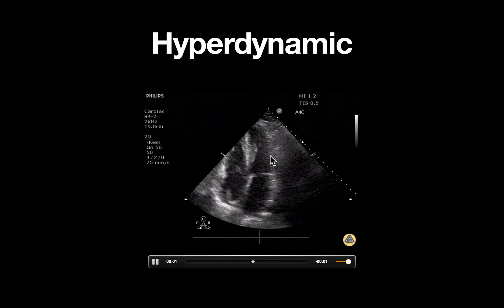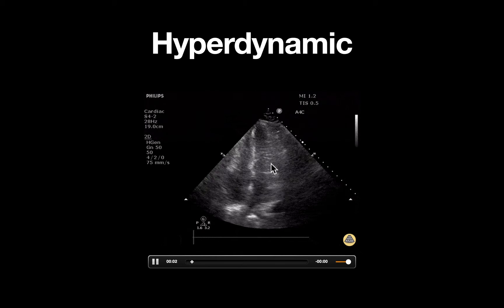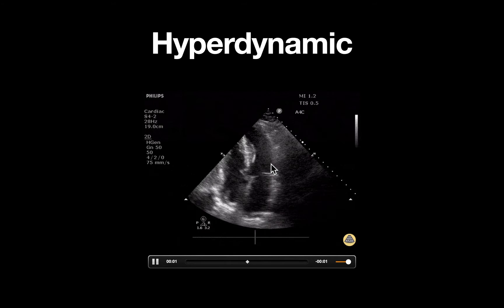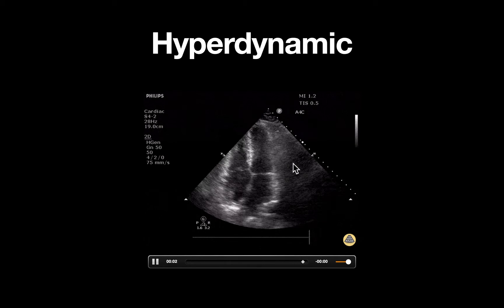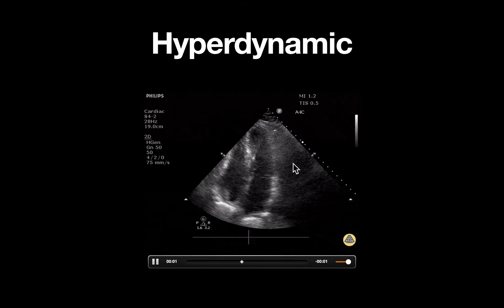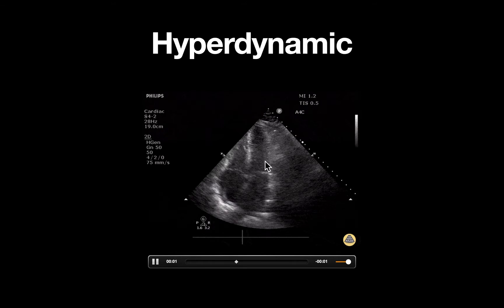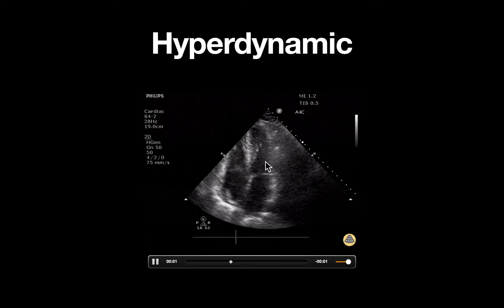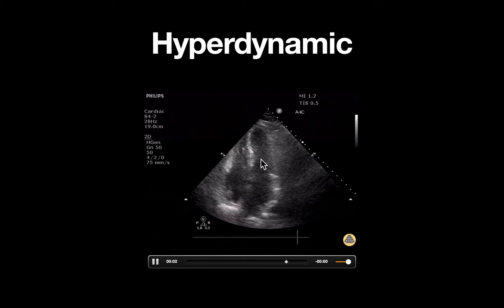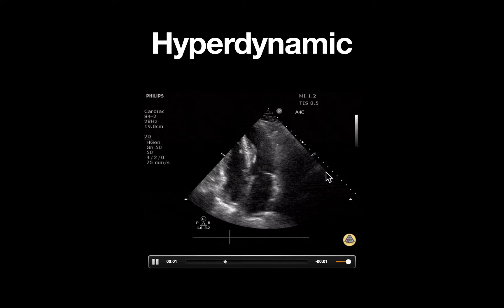Notice that in this clip the endocardial excursion and thickening of the left ventricle is increased, in this case leading to near obliteration of the left ventricle cavity during end systole.